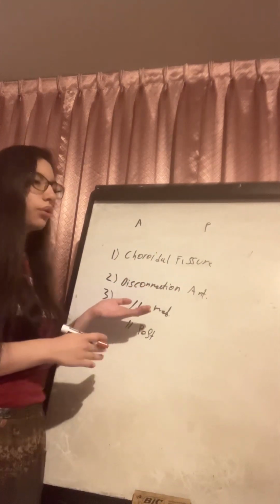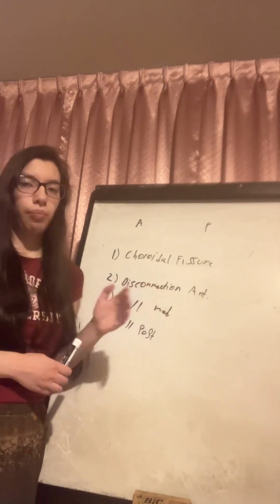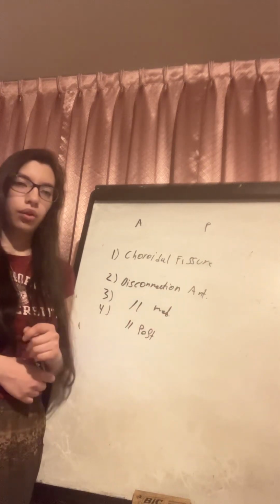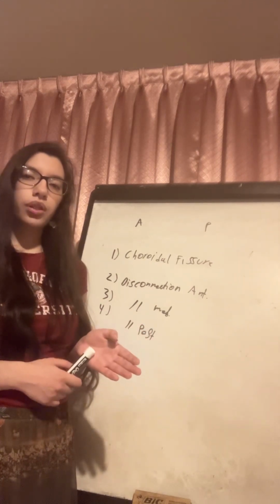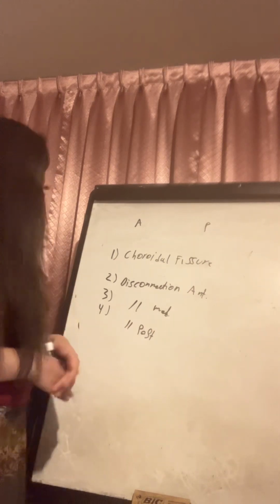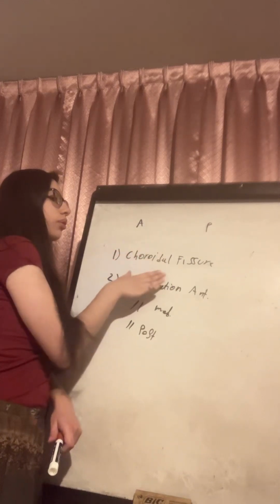The choroidal fissure marks the beginning of the hippocampal body, and a little bit more posteriorly also the beginning of the tail of the hippocampus. The head of the hippocampus is just anterior to the inferior choroidal point. So now we have an anterior segment and posterior segment of the opened choroidal fissure.